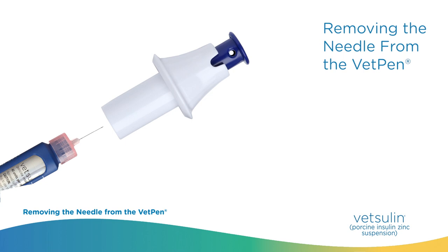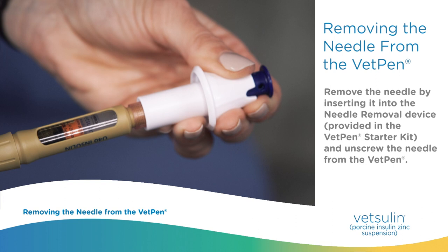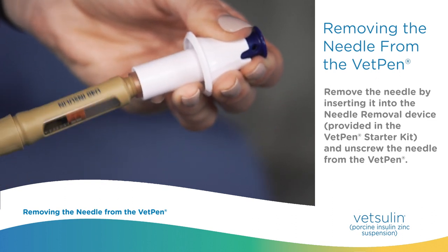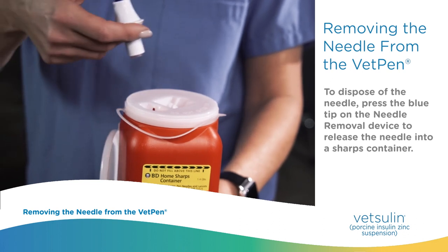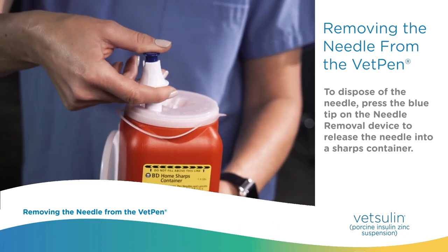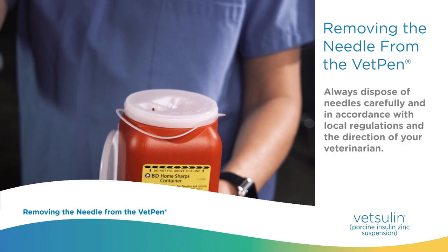Removing the needle from the VetPen. Remove the needle by inserting it into the needle removal device provided in the VetPen starter kit and unscrewing the needle from the VetPen. To dispose of the needle, press the blue tip on the needle removal device to release the needle into a sharps container. Always dispose of needles carefully and in accordance with local regulations and the direction of your veterinarian.